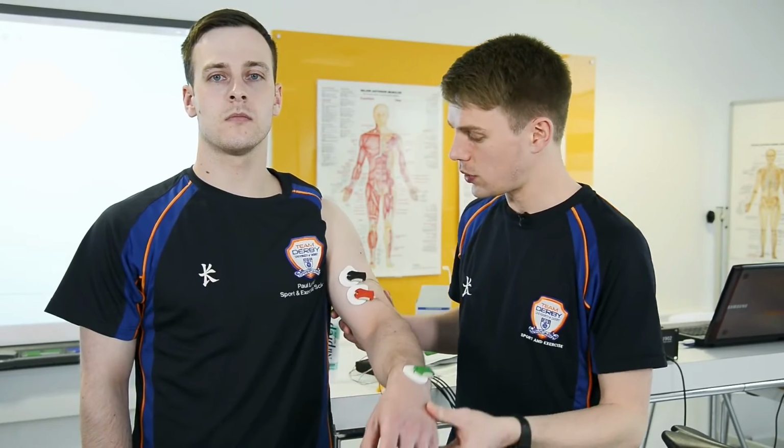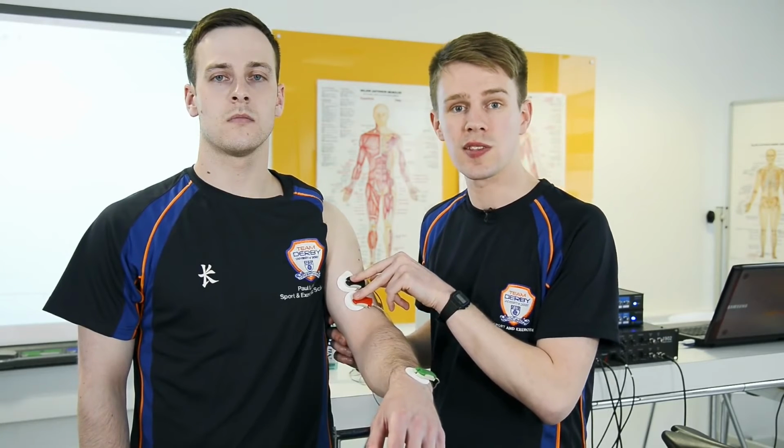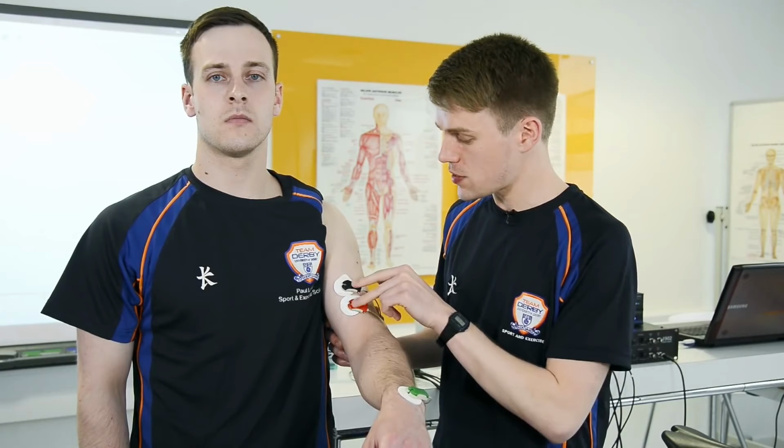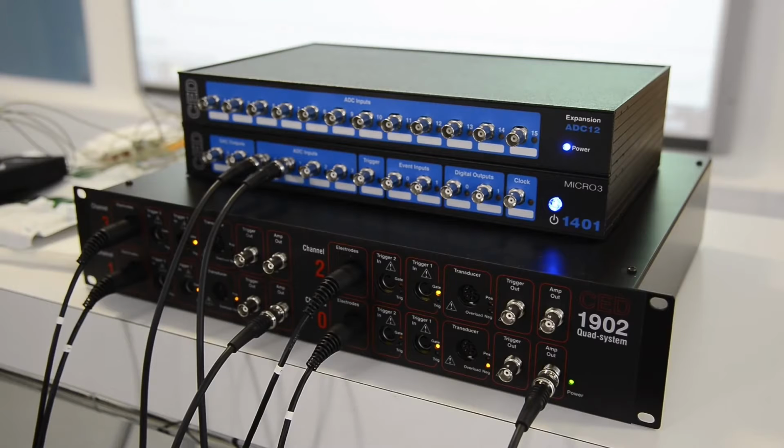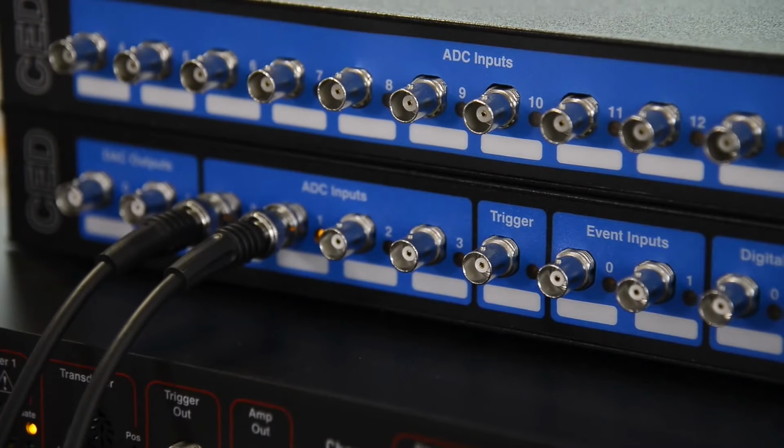This can also be applied to EMG. As electrical noise is simultaneously picked up by both electrodes, it can be cancelled by looking at the differential. However, as the two electrodes pick up slightly different versions of muscle activity, this is not removed. This process is carried out by the amplifier, which also amplifies and filters the signal, before passing it on to the data acquisition card, which digitises the signal for it to be stored on the computer.